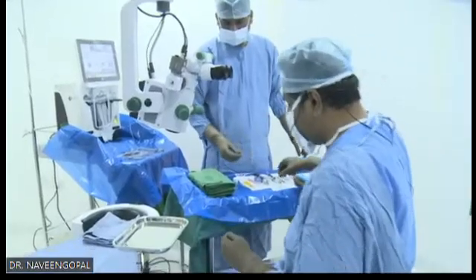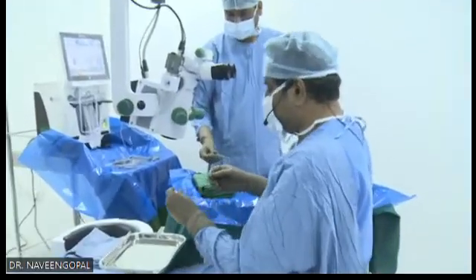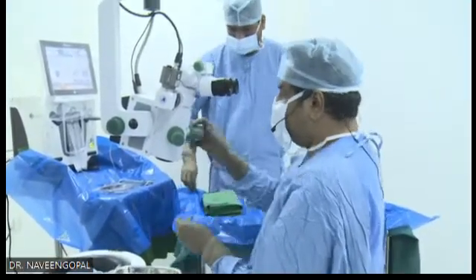Sir, if the audience has any questions, would you like to answer them at the end of the surgery, or should I ask in between? Can you go to the microscope view?